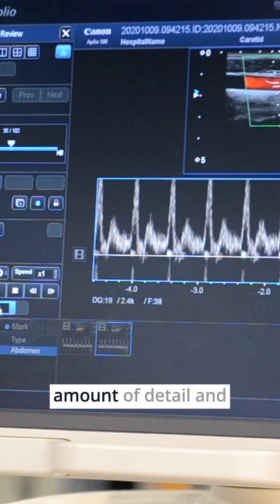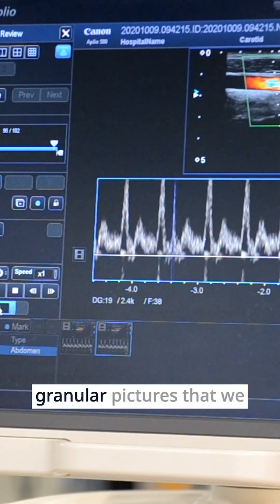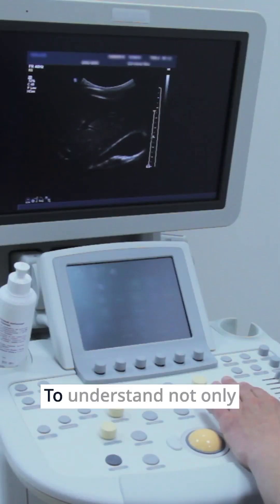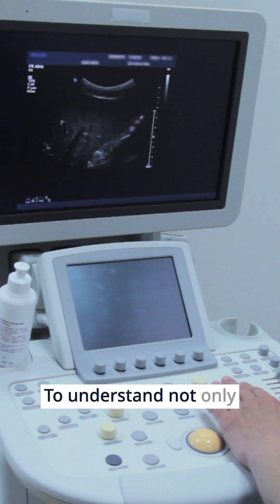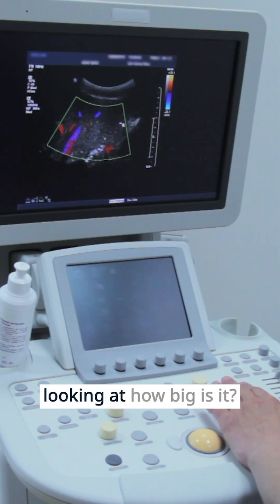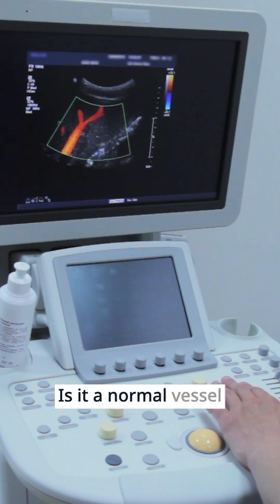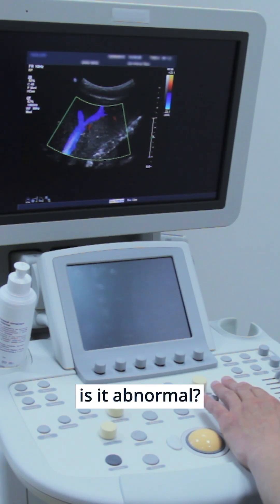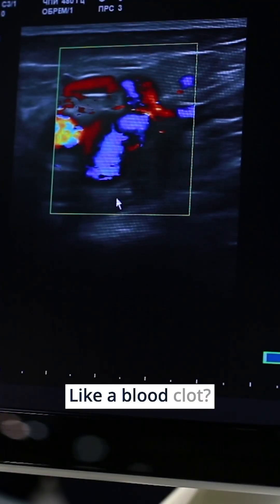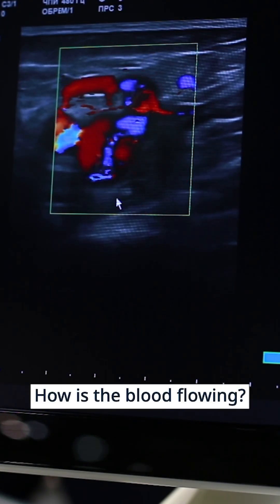What's amazing is the amount of detail and granular pictures that we can make with ultrasound to understand not only what vessel are we looking at, how big is it, are there branches, is it a normal vessel, is it abnormal, is there something inside that shouldn't be there — like a blood clot — and how is the blood flowing?